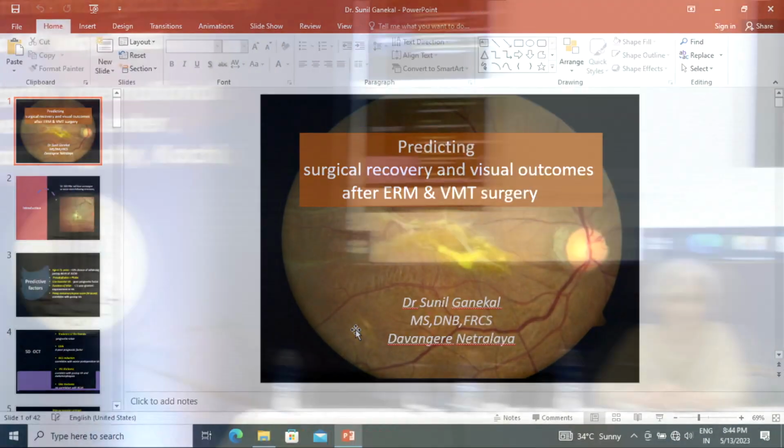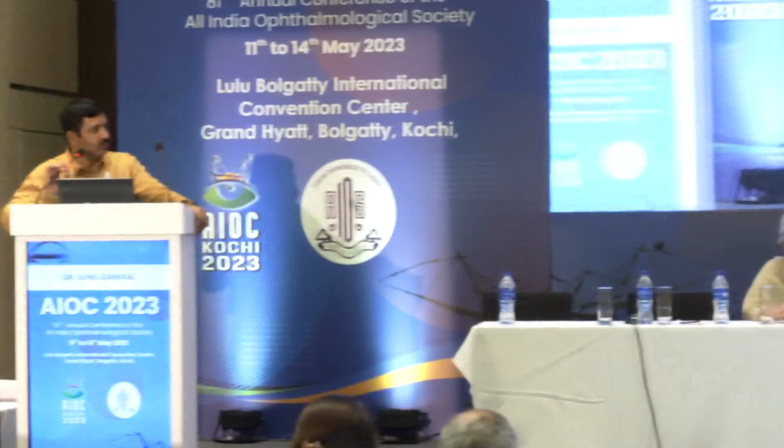Thank you, Sunil. Just to start with a couple of questions. Practically, when you look at your OCT, what do you think are the most important features that will help you detect a good functional and a good structural outcome? Yeah, the one thing is if it is associated with the ectopic inner foveal layer, definitely it's a poor prognostic factor. Since you asked specifically about the OCT, inner retinal irregularity changes as well as the ectopic inner foveal layer are the two critical things, I think. That's for the poor outcome.